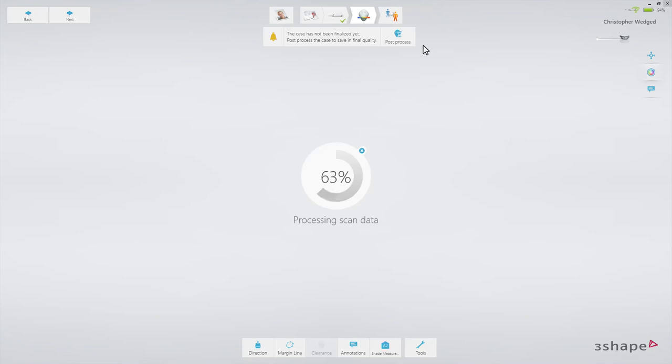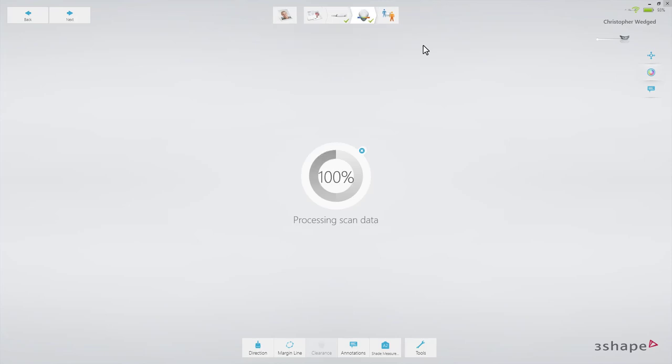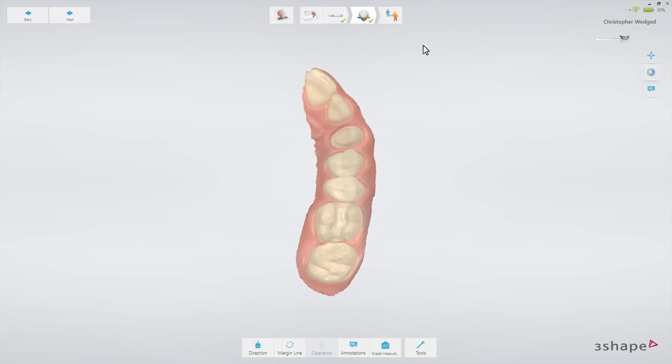If you implement any modifications of the scan later on during work — for example, adding an HD photo — you'll need to do post-processing once again.